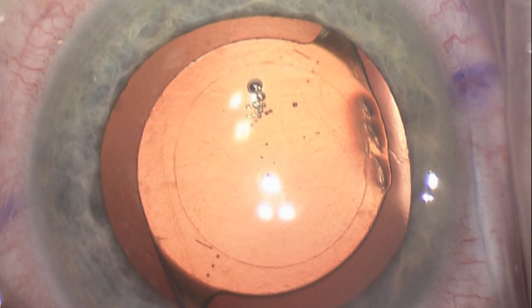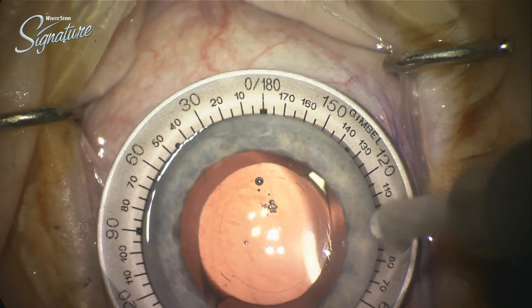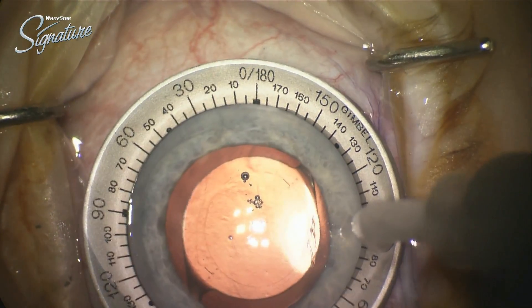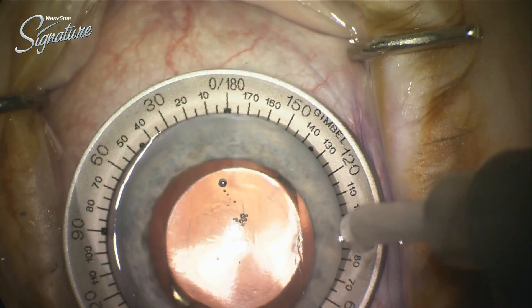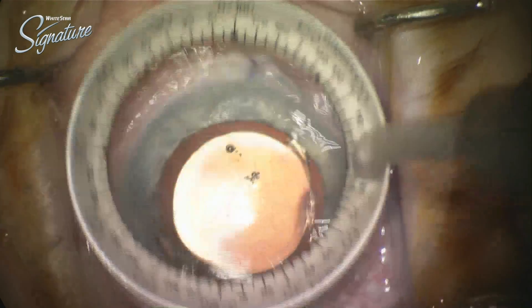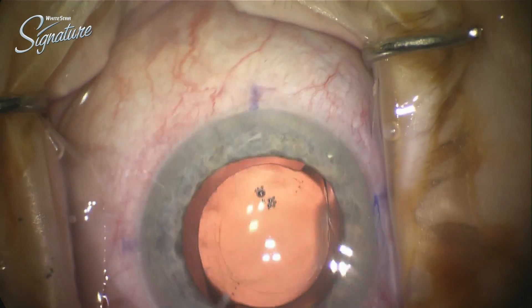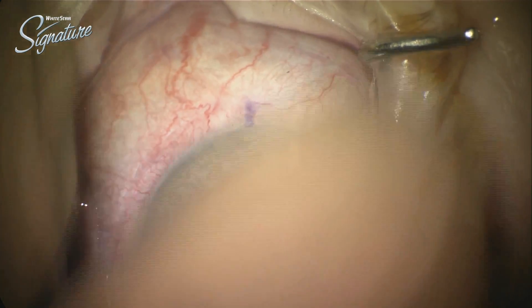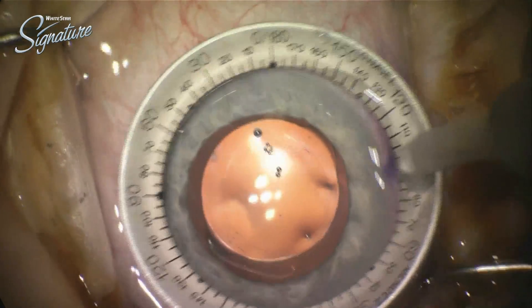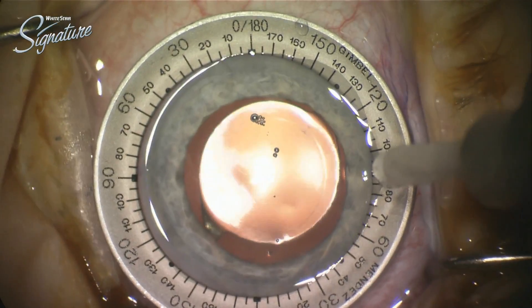Had I known that I was going to be demonstrating this technique, I probably would have attained images with a little less parallax error. But in this case, we're using the toric alignment ring to match it up with the marks I had made at the slit lamp in the preoperative area. I found the alignment was absolutely fantastic — I was delighted, fairly certain we were very much done with this case. But of course there wouldn't be a part three to this story, given that this is part two, if I was completely done.